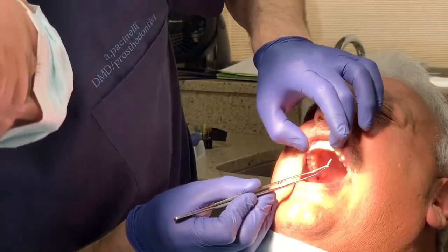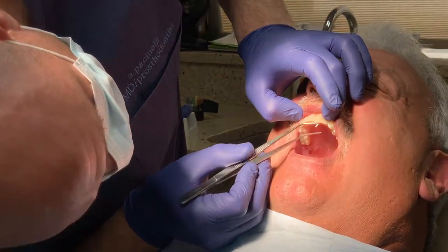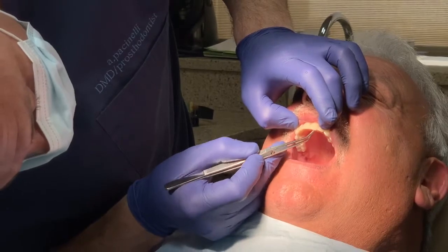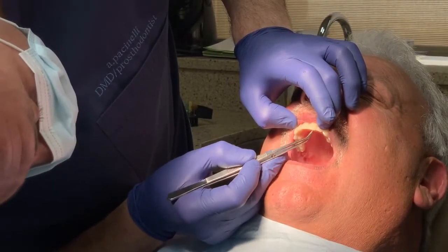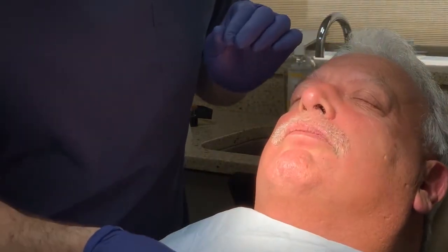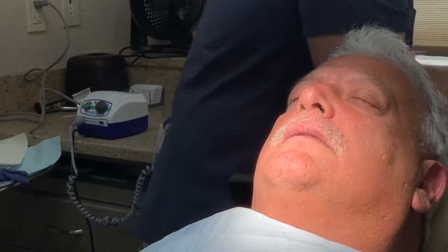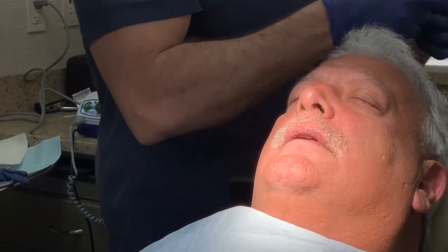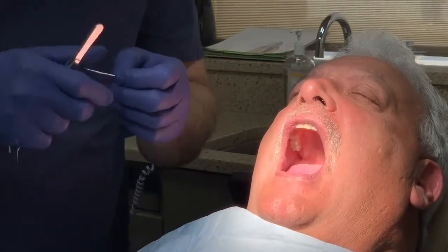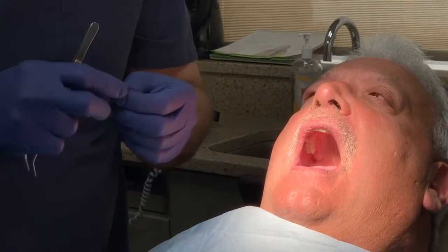I generally put it in with a clip and bring the patient back after a re-eval. I make sure everything's okay and they're functioning okay, and that I don't have to make any modifications where I have to unscrew it. And if everything is good, I'll seal it at that point with composite. The composite will bond to this material. But you technically don't have to.